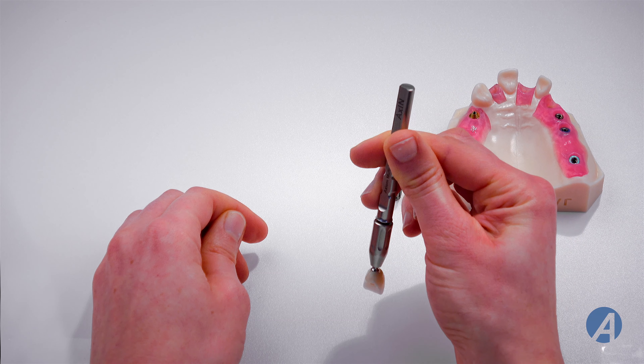Position the tooth in the implant and screw to 25 newton centimetres using a golden ball ancillary. Use a prosthesis dynamometric wrench or a torque control equipped with a ball mandrel to help you.